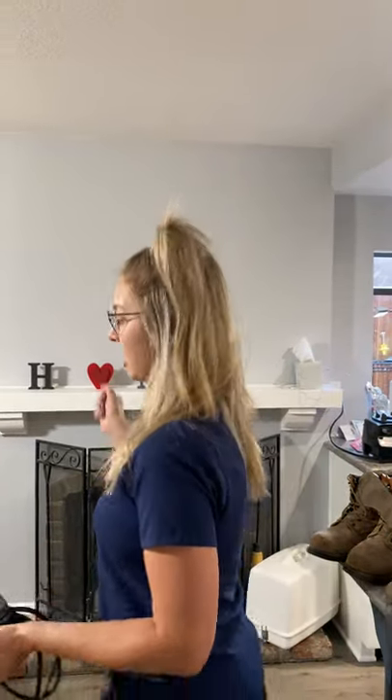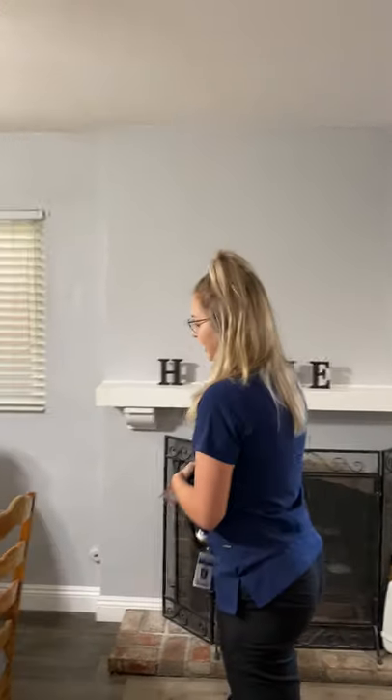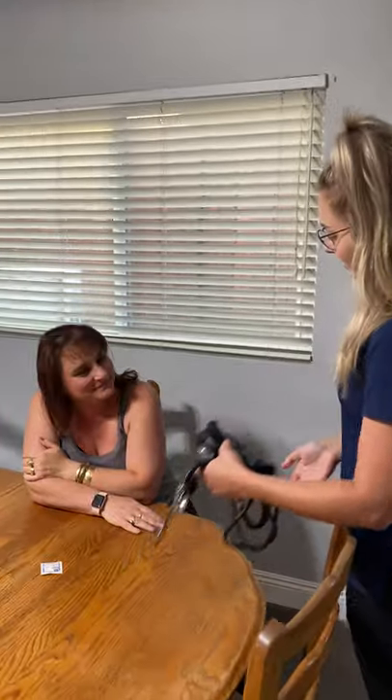Before I go in, I'm going to make sure I have all my materials and I'm ready to go. My mom is going to be my volunteer. We're going to do our normal entrance — we're going to knock. Hi Crystal, I'm going to do your CNA today and I'm just going to check your blood pressure really fast.